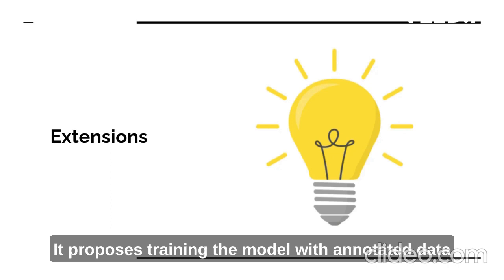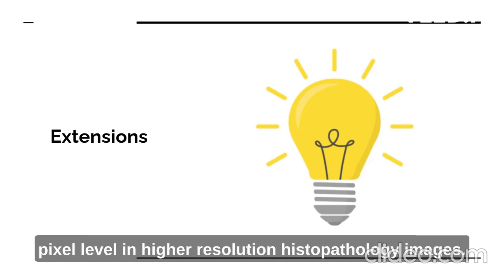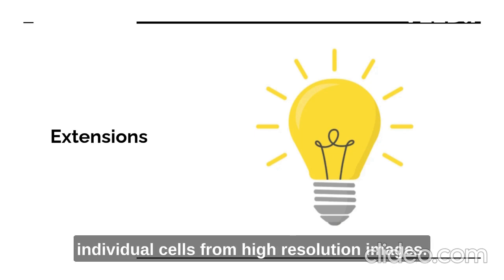It proposes training the model with annotated data to detect and segment individual cells at a pixel level in high resolution histopathology images, unlike our approach for assignment 2. This yields more precise detection of individual cells from high resolution images.